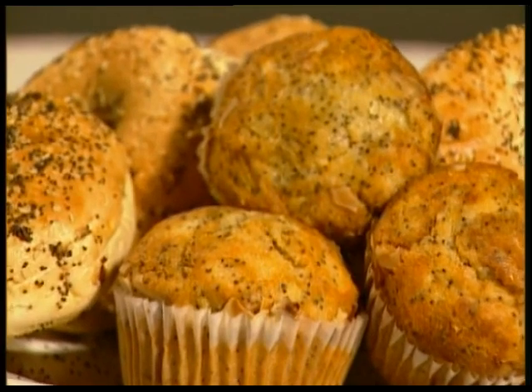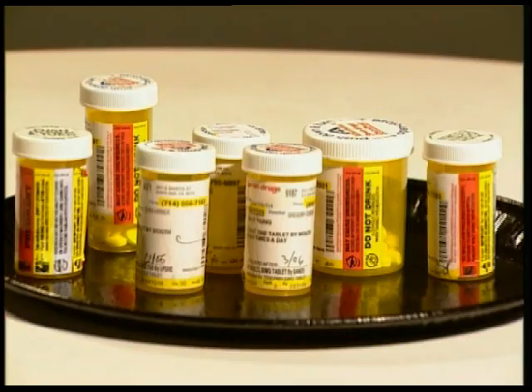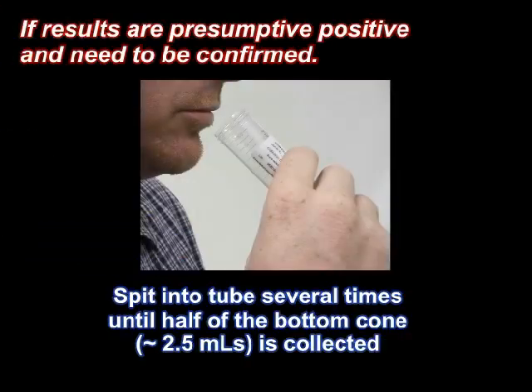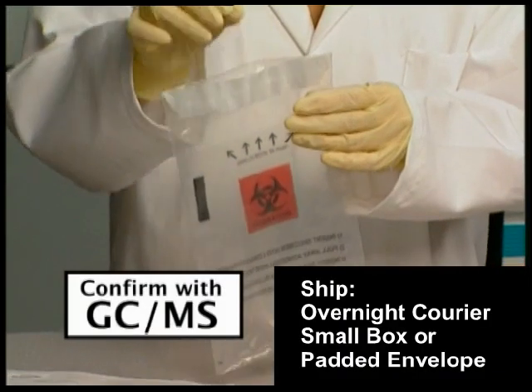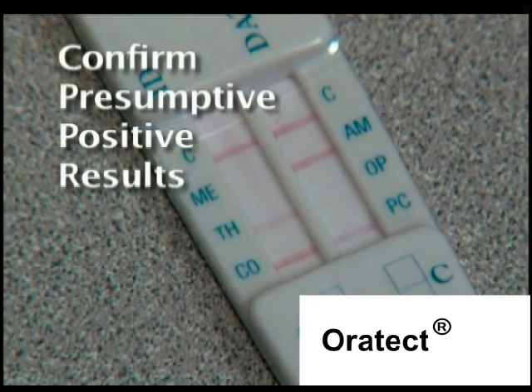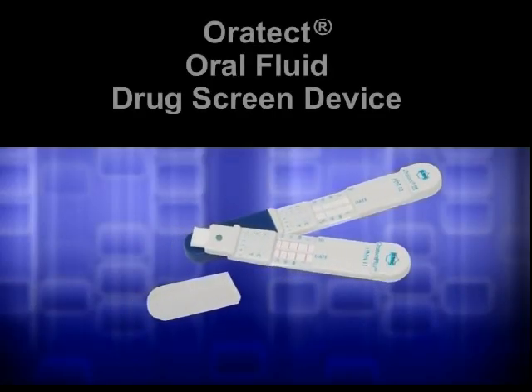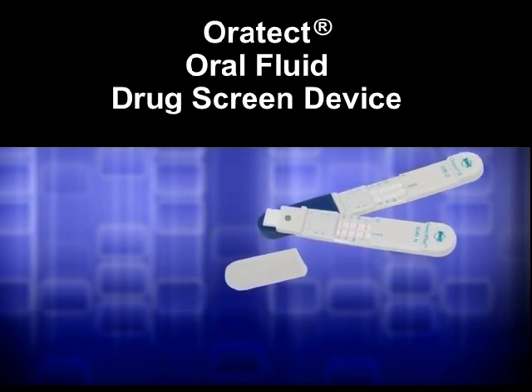Substances in certain foods and/or medications may interfere with the test and cause a cross-reaction. We recommend that samples indicating a presumptive positive result be confirmed with a more specific quantitative method, such as gas chromatography mass spectrometry. For more information or technical assistance, please review your Oratect or Oratect Plus package insert.